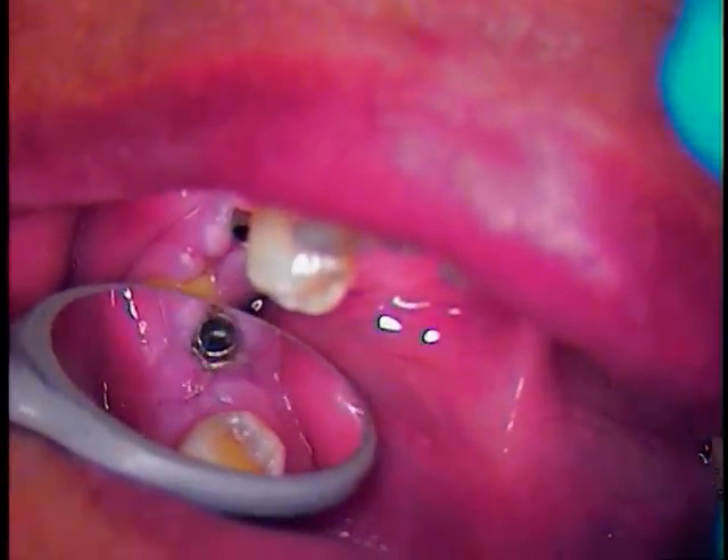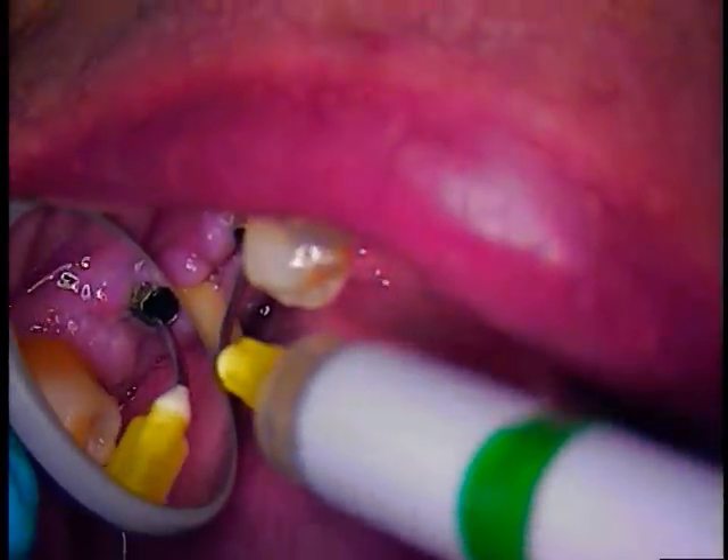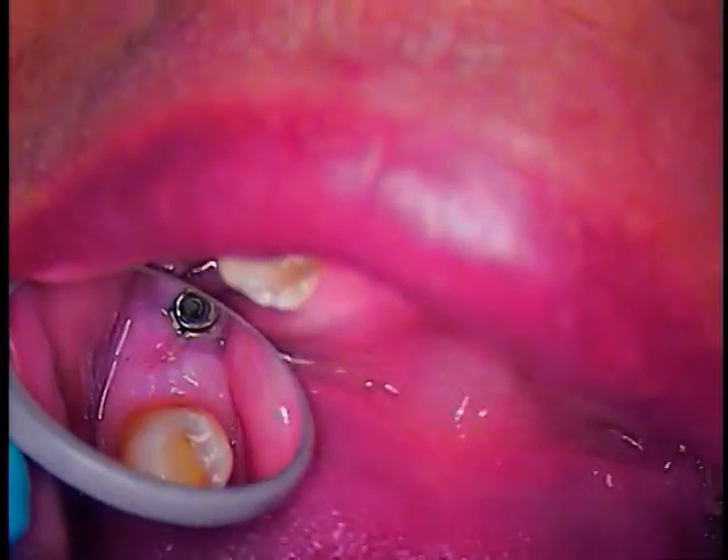We'll need a microsuction. We're going to use microsuction now and go inside to remove some of the fluids.